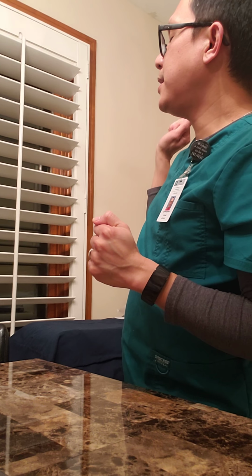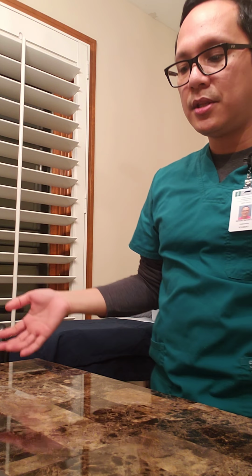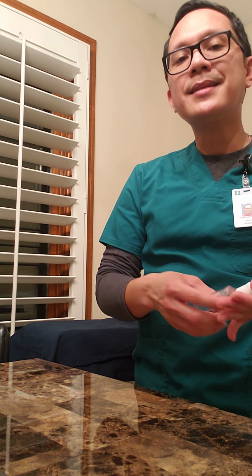So if everything is done, then you can perform your hand hygiene, open the curtain back and make sure that the patient is good and all right, and make sure you reassess the patient after an hour or 30 minutes before your shift ends.